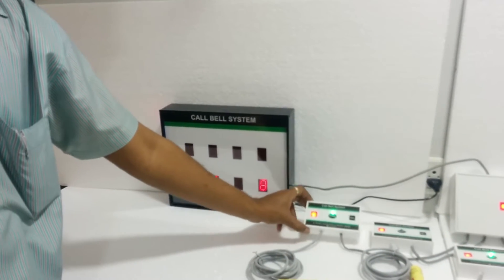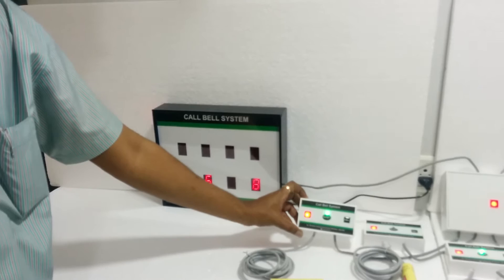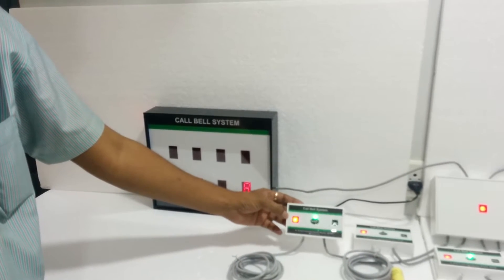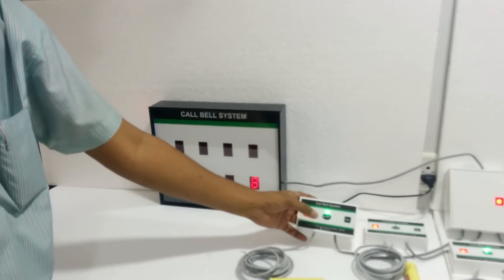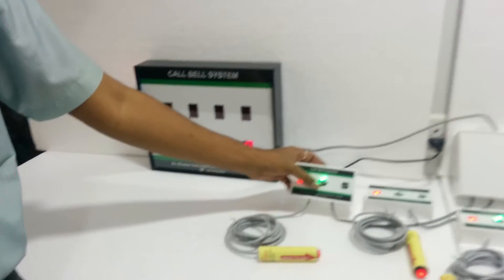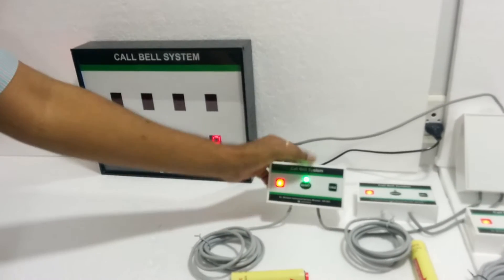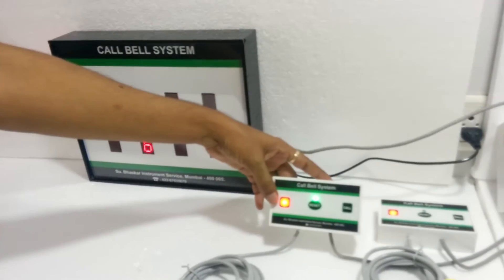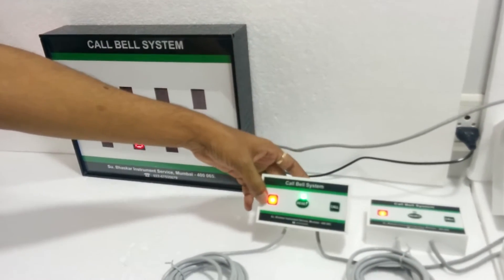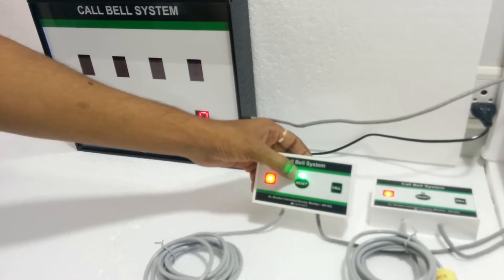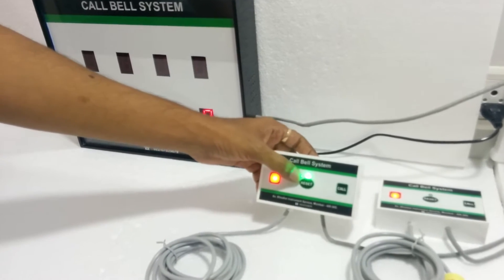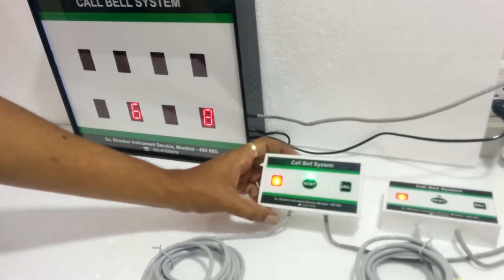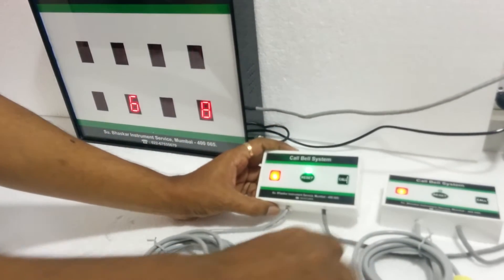These are calling stations at bed end. There are 2 switches. One is reset, one is call. There is an indicator that permanently glows, and there is a green indicator which glows once the patient calls for the nurse.